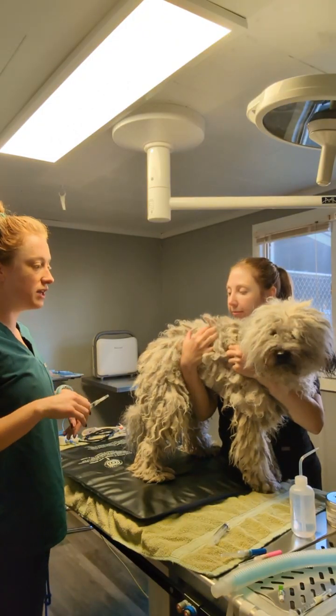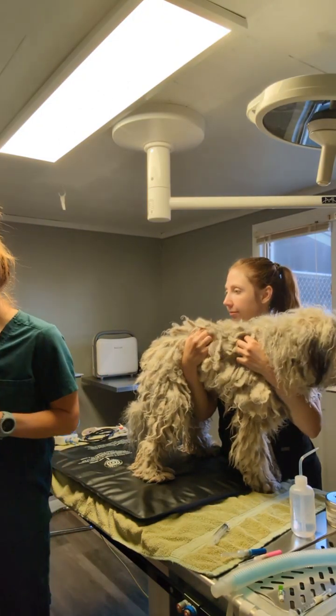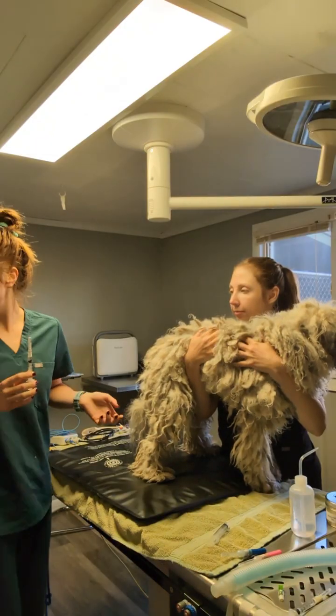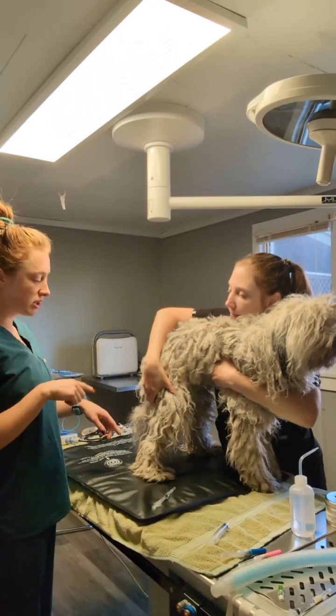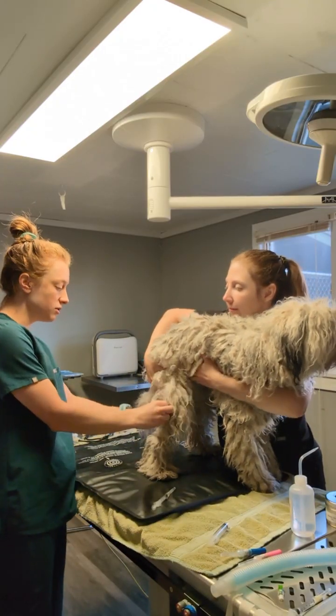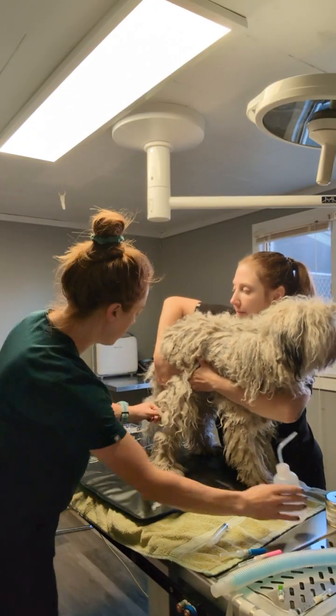So we're about to use our pre-med. We're going to do an IV injection, and we have chosen hydromorphone and ketamine for this. So I'm going to ideally inject the pre-med IV into a saphenous vein so we can save the cephalic for her catheter.